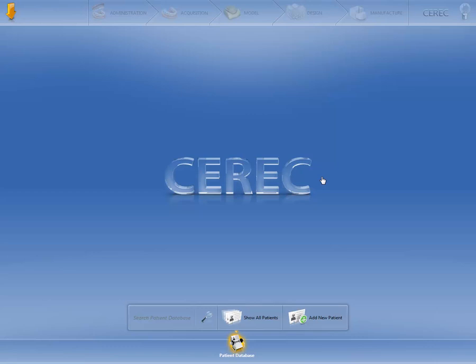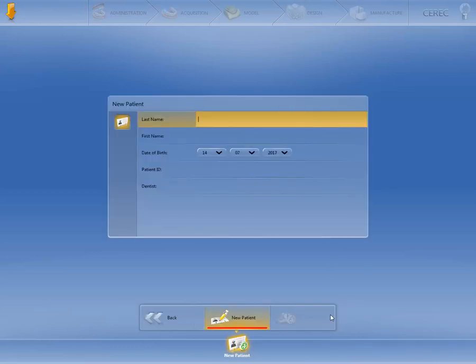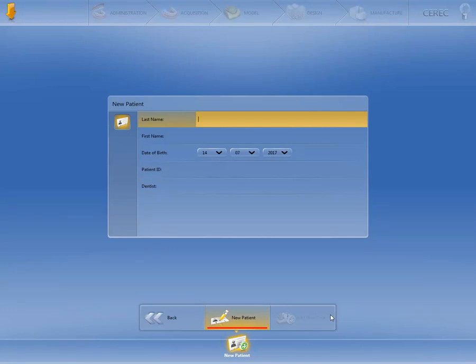In our example, we are adding a new patient. A new window opens in which you enter the patient data. You need either the patient ID or the last name, first name, and date of birth. You can only open a new case once all of the required fields have been completed.